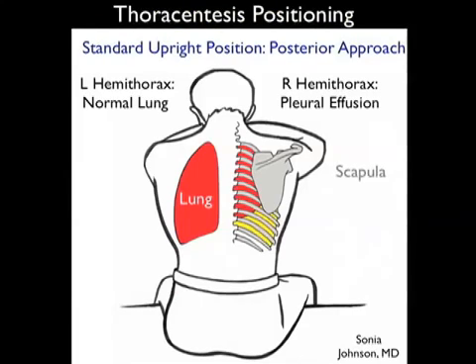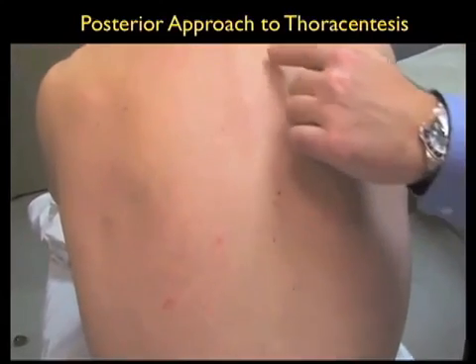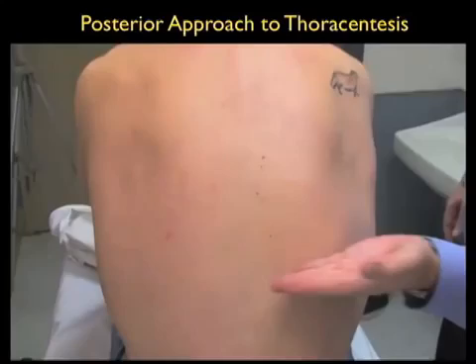Here we note the second traditional positioning of the patient for the thoracentesis procedure, which is the standard upright position in which the needle would come in from a posterior approach, and we note the patient bending forward over a stand or a table. Here we see a pleural effusion within the right chest, and we note here the patient has a puncture point that would come in into the pleural effusion below the scapula but above the layer of the diaphragm. In this video clip, I'll outline some of the surface anatomy important for the posterior approach to the thoracentesis procedure. Here's about the level of the scapula on the posterior chest wall, and this is about the level of the diaphragm.